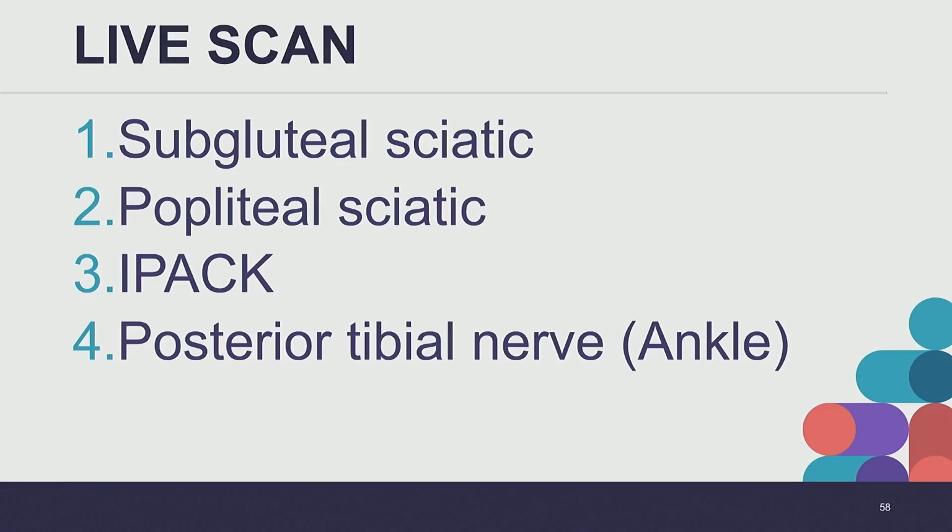I typically use stim with this because, I mean, her anatomy looks great, but there are times when you're scanning and you see 4 different hypoechoic structures, and you're wondering which one's the nerve, and so the stim becomes very helpful for this block.